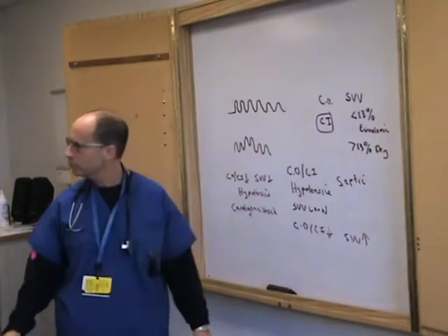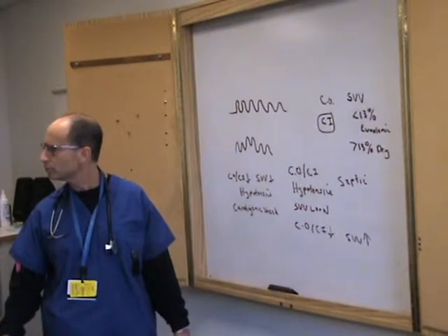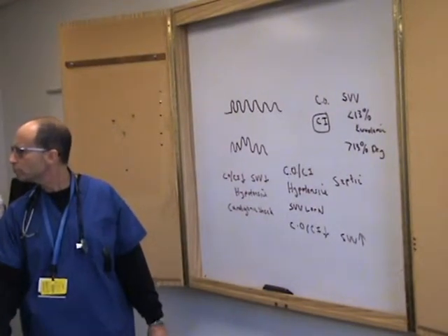Steve, yeah, quick question. SVV, from what I've read, how accurate is it in patients that are not intubated?